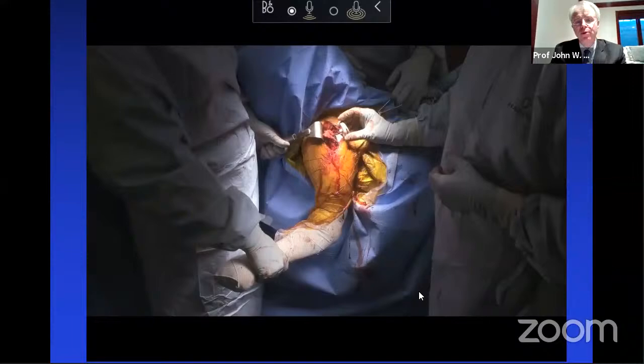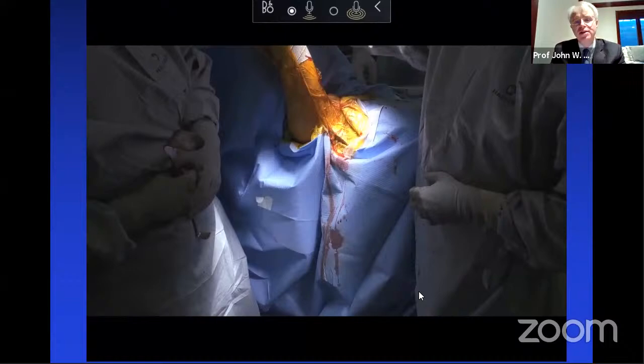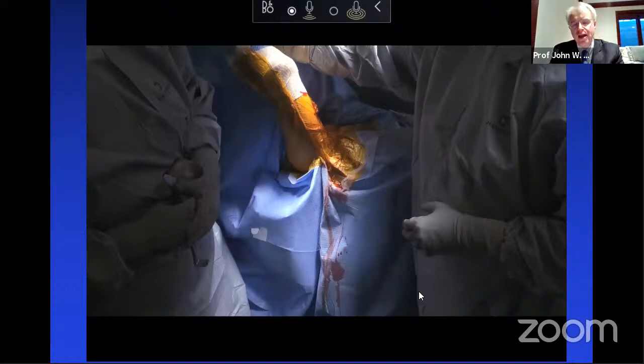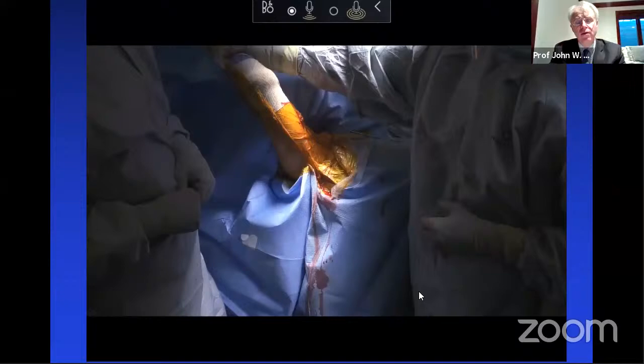So this is a standard tray, and what you'll see is when we reduce it, we'll raise the arm up in the air and you'll get some impingement. We get about 110 degrees of elevation that way. And then what we'll do is we'll switch to a +3 offset tray, and you'll see improved overhead elevation. I really like the study, again, Professor O did, looking at this issue and how offset trays can improve it. So we get improved overhead elevation now with a +3 offset tray.